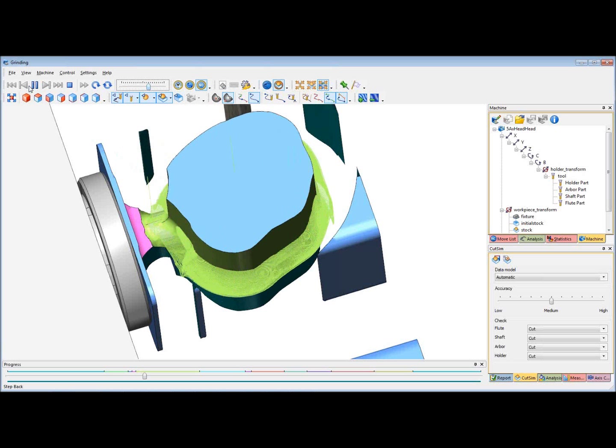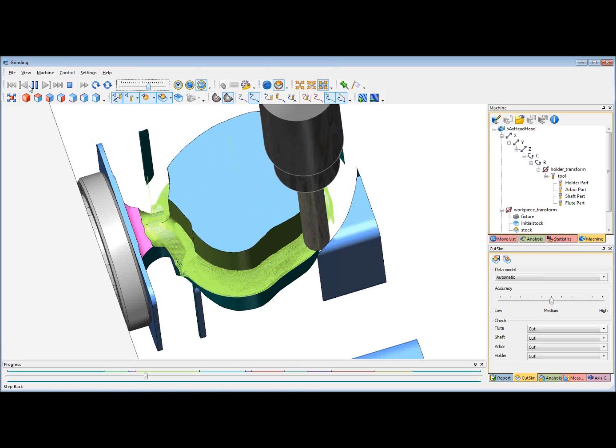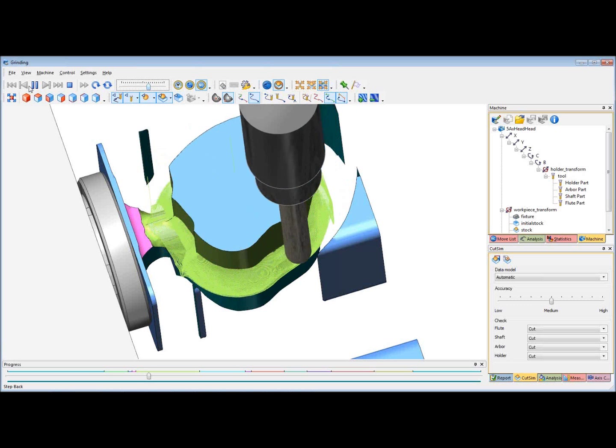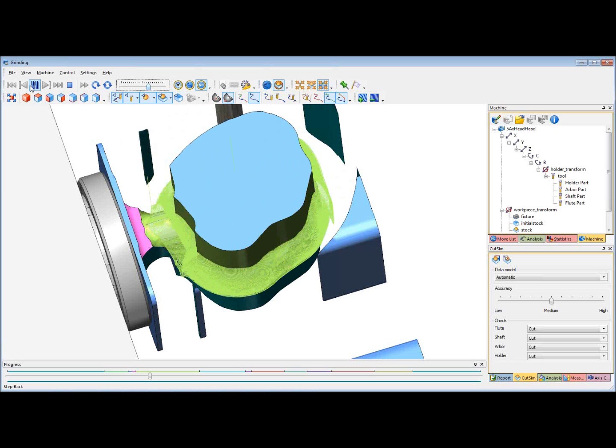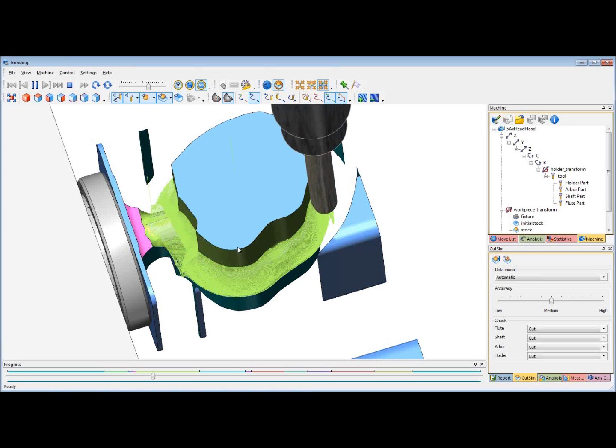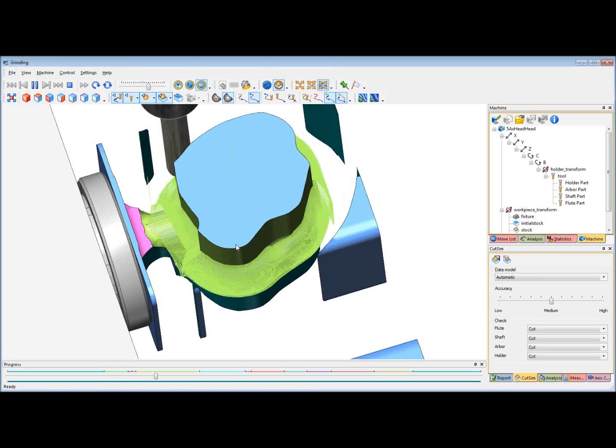Because the grinding tools can only remove material using its sides, so it's more efficient milling with the sides. We have the cycles which are dedicated for this. So we'll also see other cycles doing the same, so we move from the ordering, it's always from out to in.